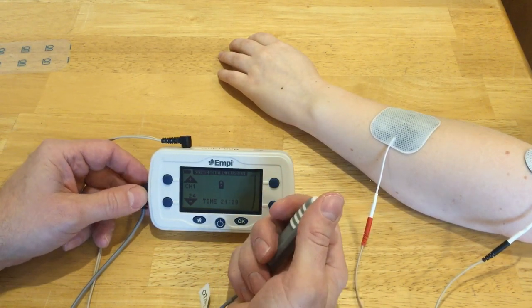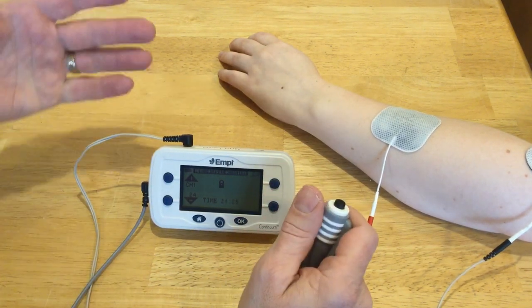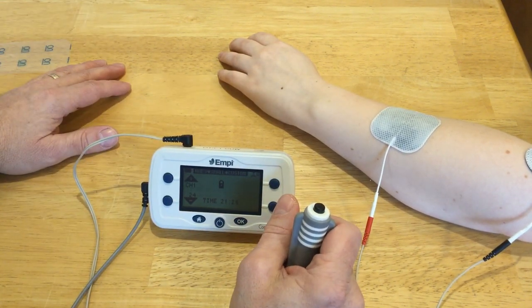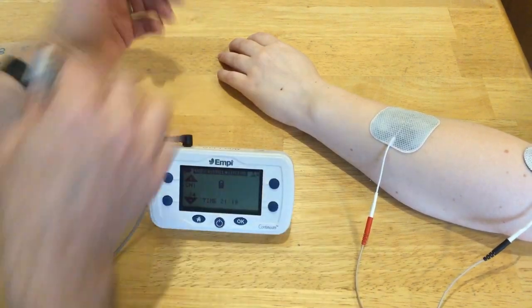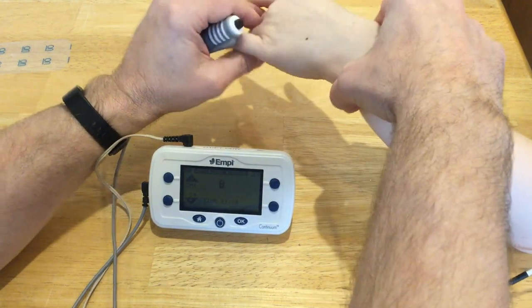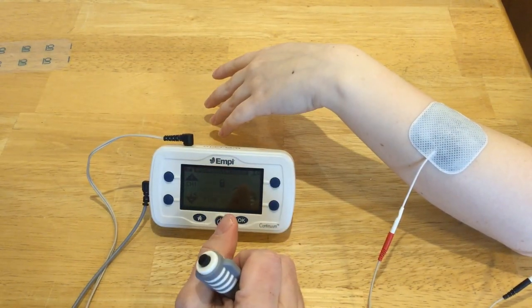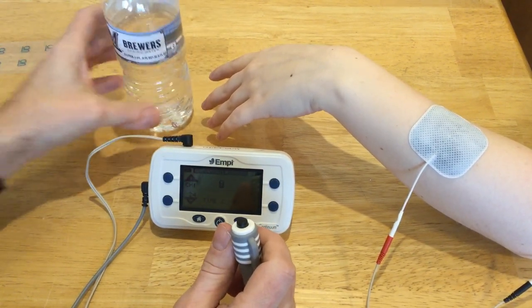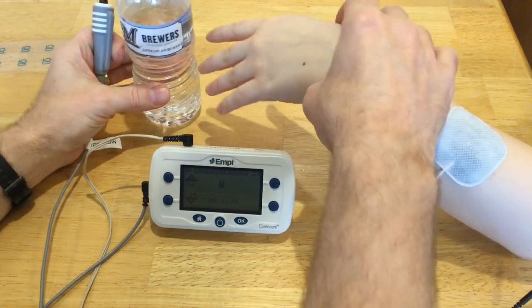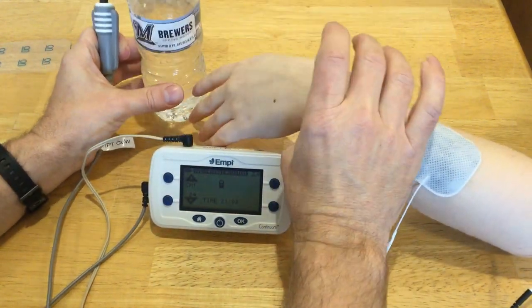The ramp up and ramp down still work, but the switch will control the on and the off. So if my patient had a radial nerve palsy and wasn't able to extend her wrist — just let your wrist flop — with the wrist flopped like that it's not very functional. Say I have a bottle and I want her to grab it, but she can't extend her wrist — she'll just run into it.